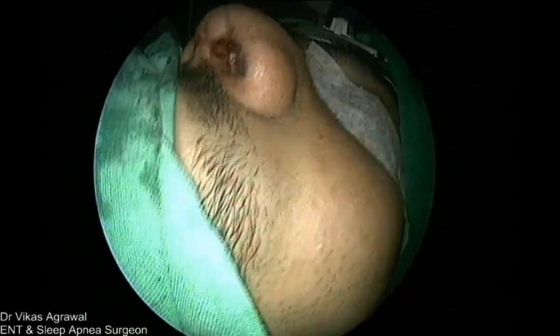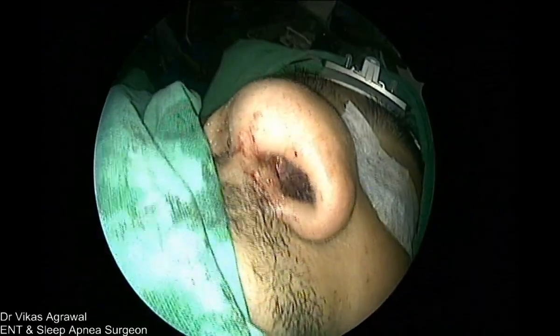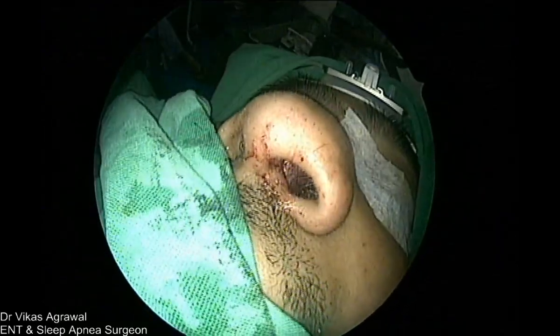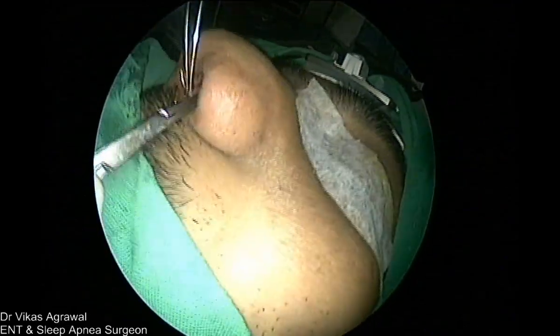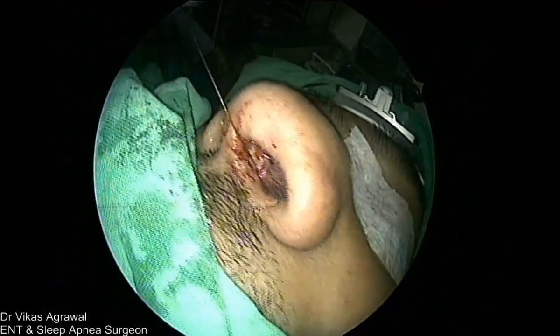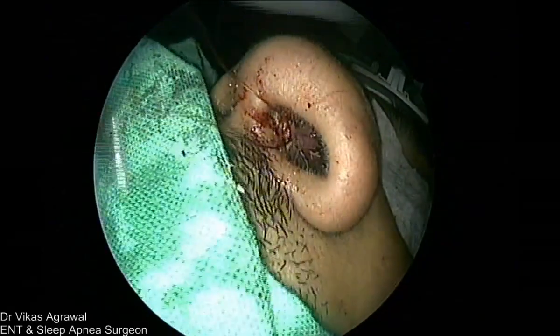Cut it. Cut it. So just 1 second to finish off this suture. Even 1 should be alright, but we can always take 2. This is a chromic catgut, so it will fall off by itself, need not be removed.